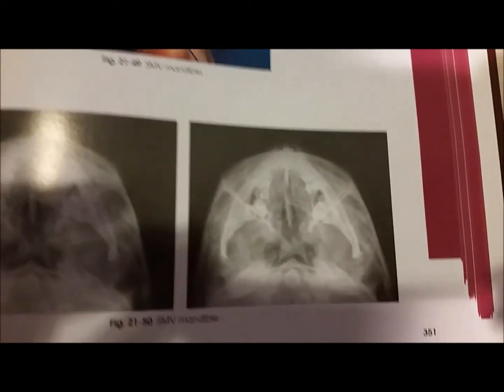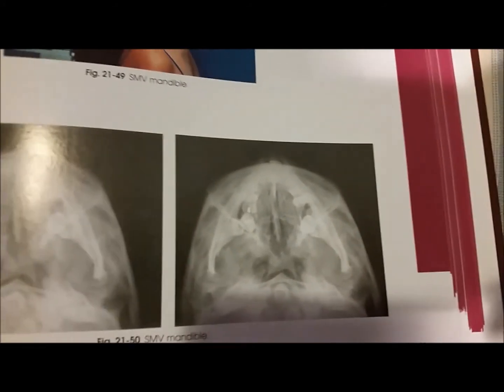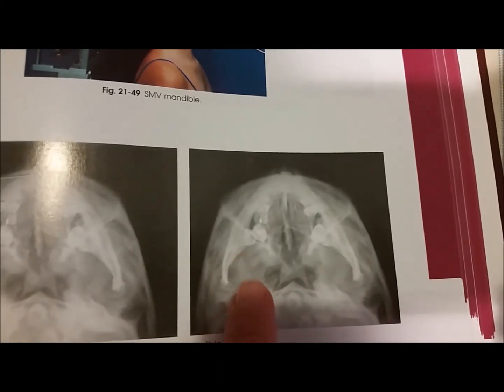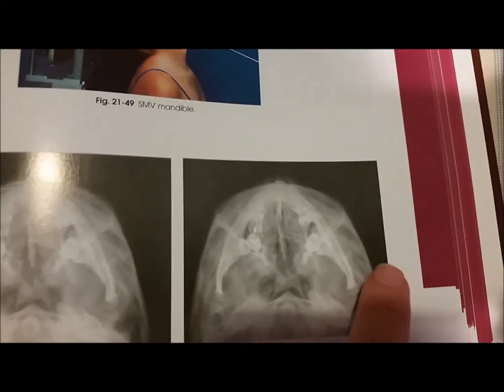Finally, we have our SMV, or submentovertical projection here of the mandible. You should be able to make out the body and the condyles right there on the sides.